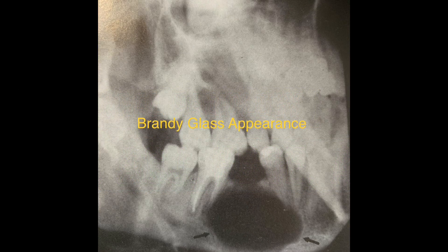This is a clip demonstrating how a particular appearance looks in a radiograph. This lesion is actually a residual radicular cyst, and this kind of configuration or appearance is called as brandy glass appearance.